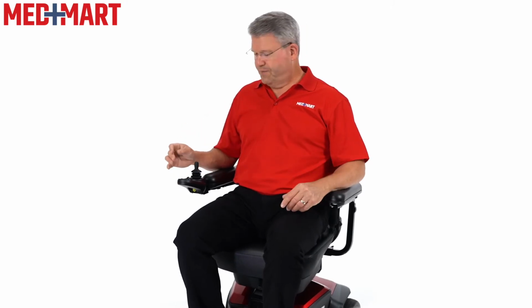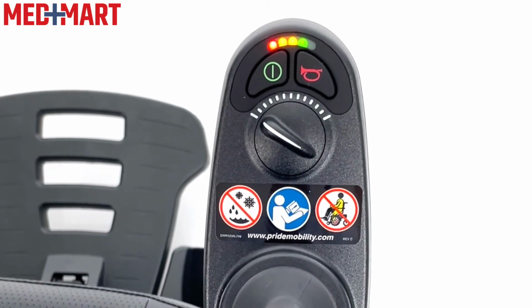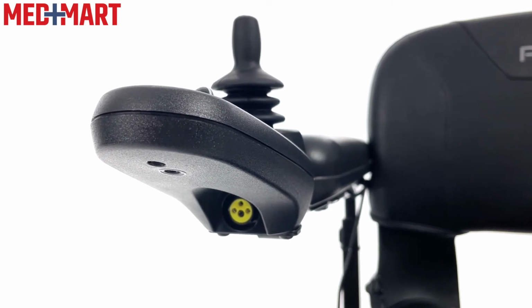I can also move the joystick forward a little bit, as I mentioned, to allow a little more comfort and relaxation when it hits my hand. Even set up right now, if I had to use this chair for the day, I easily could do this. On here is my power, which tells me my indicators and how many bars are left as far as the battery. On the bottom of the joystick is the charging port that I went over earlier, so it makes it really easy to plug that in here.